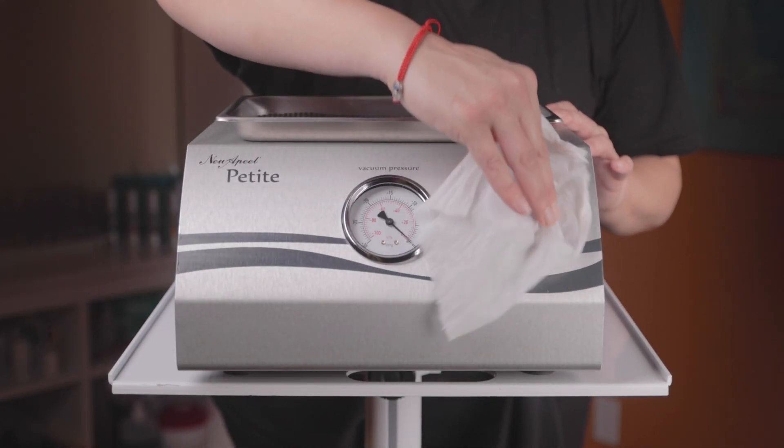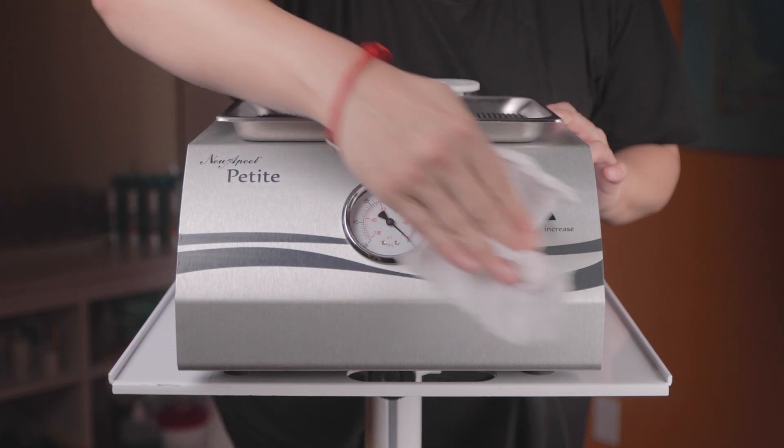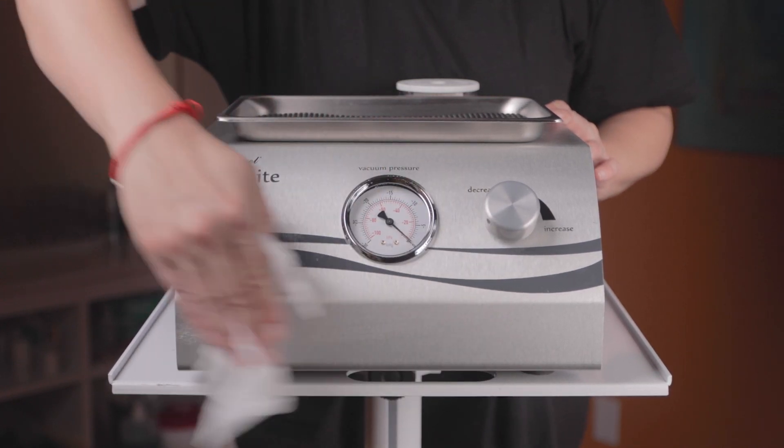Care and cleaning for the diamond tone petite system is simple. Just wipe down the exterior with a damp cloth and mild liquid detergent. Do not use harsh cleansers or disinfectants because they may cause corrosion.